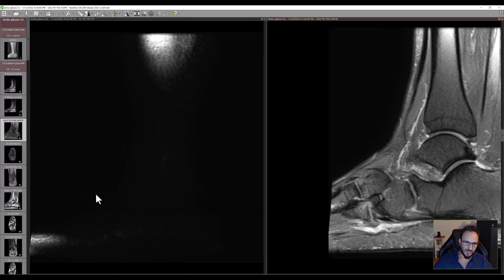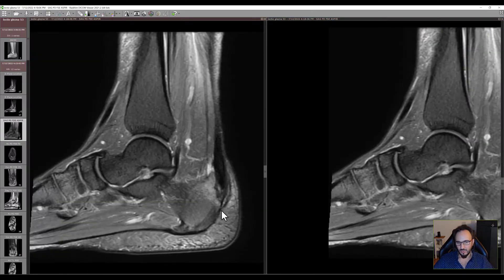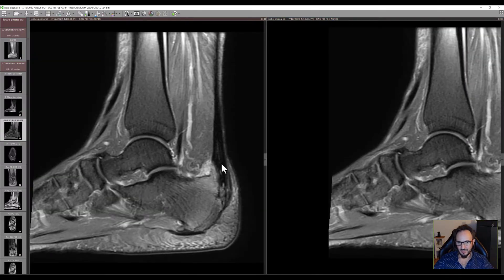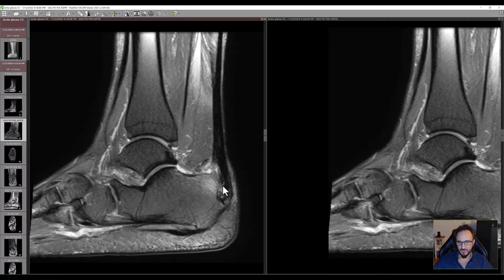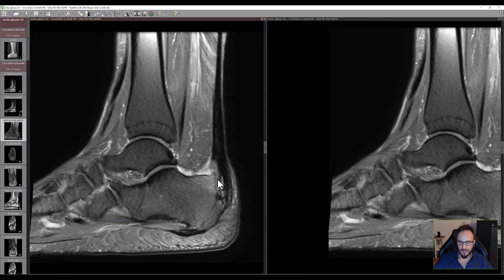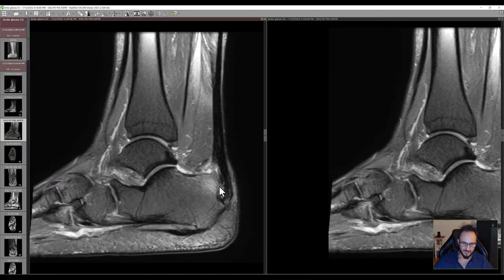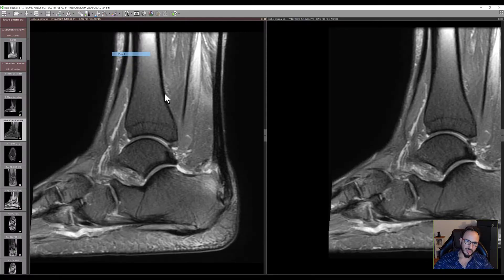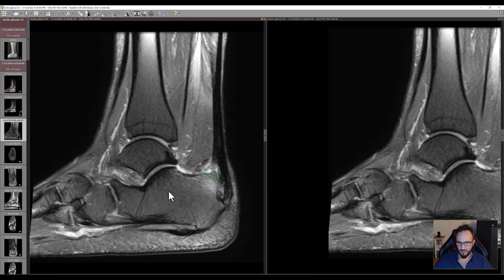Nevertheless, the most important finding is this Haglund deformity, which causes the Achilles tendon to suffer and to be partially torn. And she needs surgery. She needs the surgeon to come and cut — this area of the bone should go off, so the tendon will not be impinged anymore.